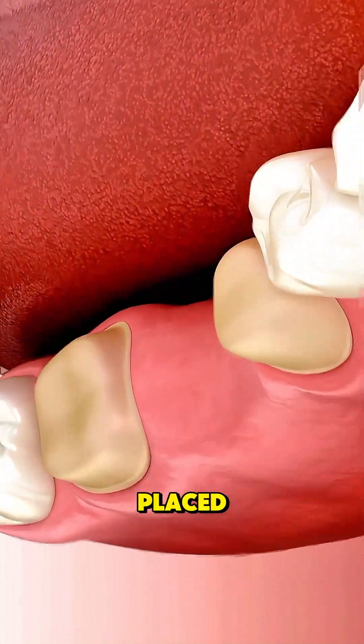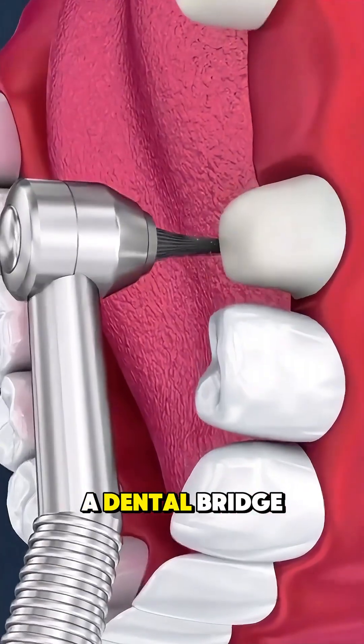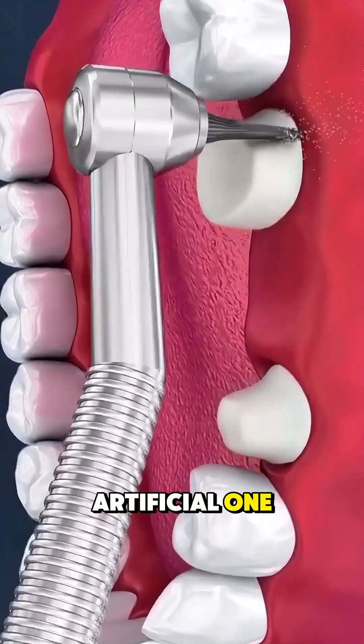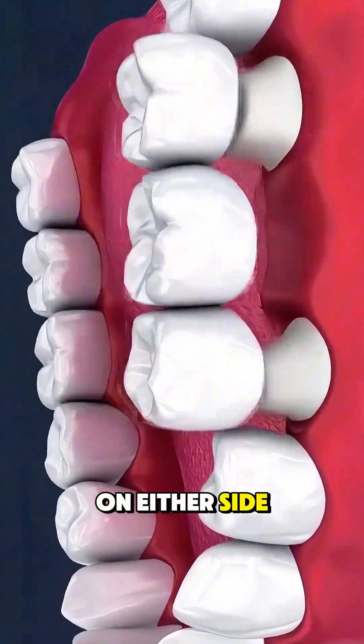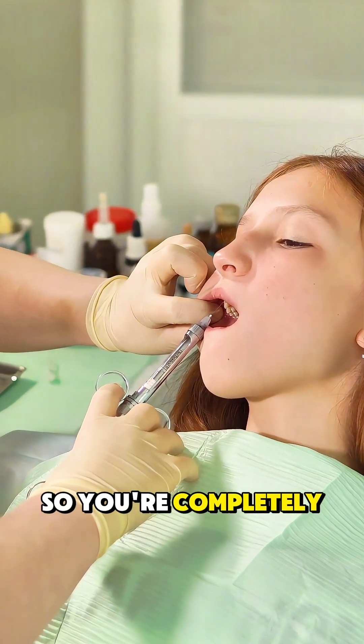Ever wonder how dental bridges are placed? Here's a simple, smooth breakdown of the process. A dental bridge is used to replace a missing tooth by anchoring an artificial one to the teeth on either side. It usually starts with the dentist numbing the area so you're completely comfortable.